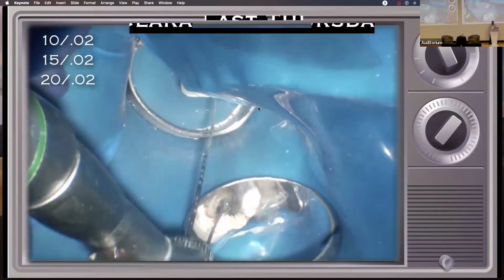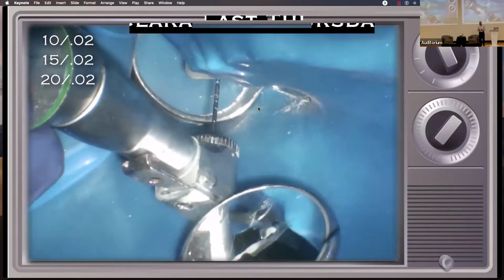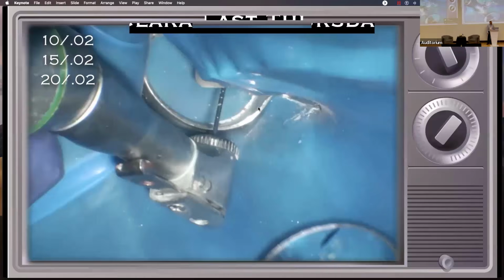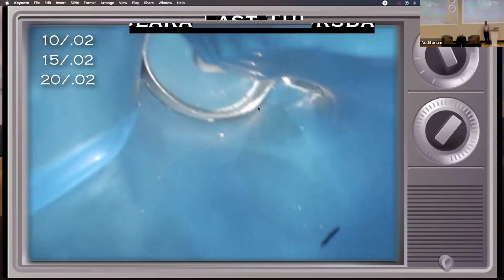And then, that one didn't seem to want to go all the way down. That's okay. DB went pretty much all the way down. That's it for rotaries. That's it for rotary files.